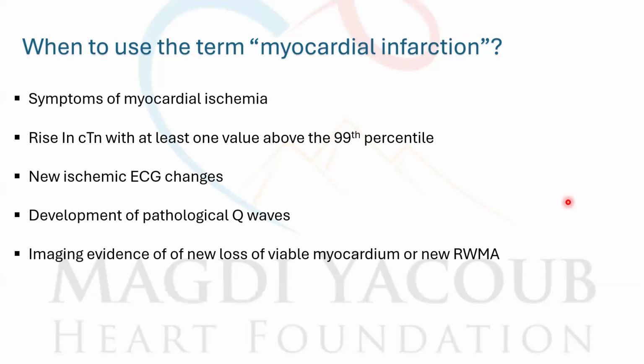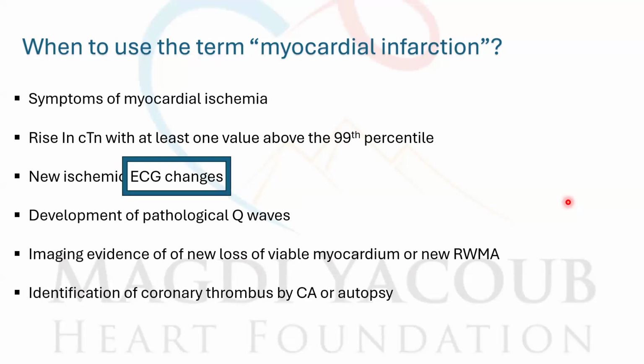Now, these lectures are more EKG-based. So in this lecture, we'll be focusing more on the EKG changes that happen in myocardial ischemia or infarction.